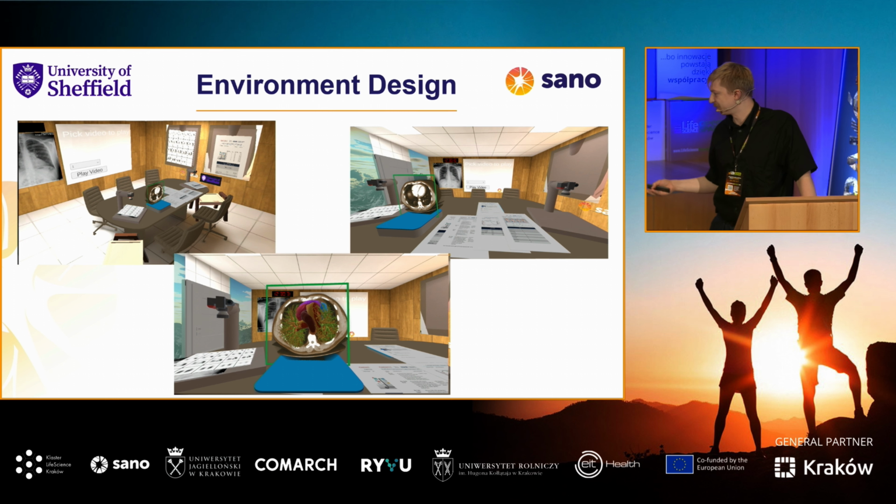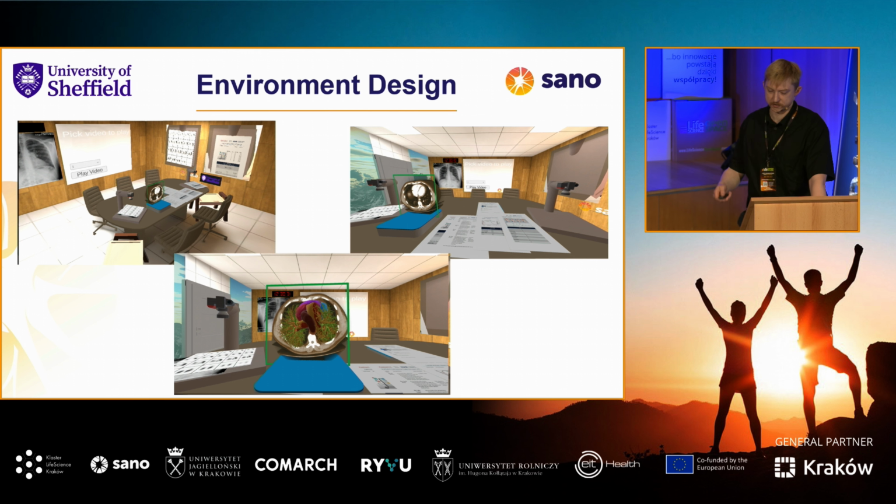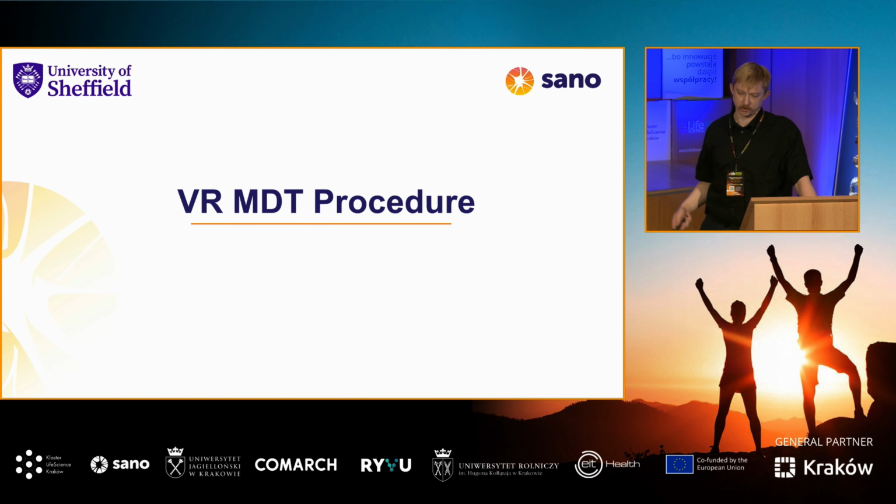But also other things that are not really possible in real life, at least not in physicality: a CT scan of a patient with segmentation overlays on it, which you could also grab and look at up close, and put under the overhead projector, so you can display it on a larger screen. So the aim was to be as intuitive and as natural as possible, just to facilitate the information transfer as much as possible.